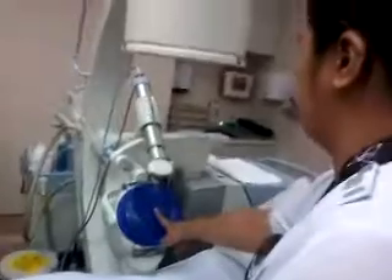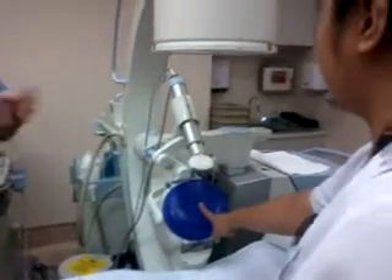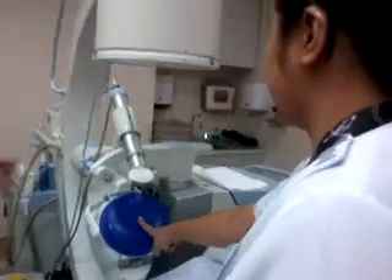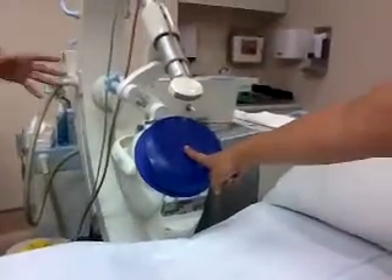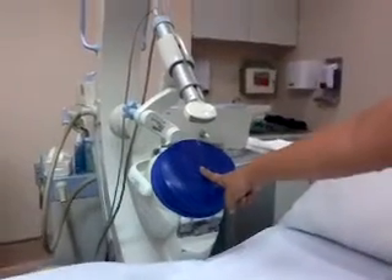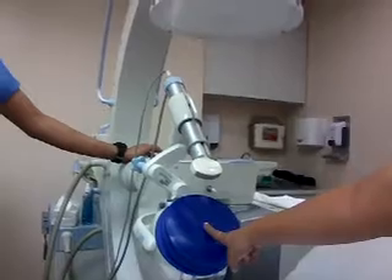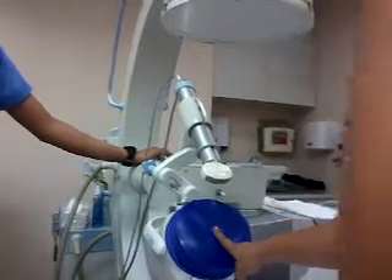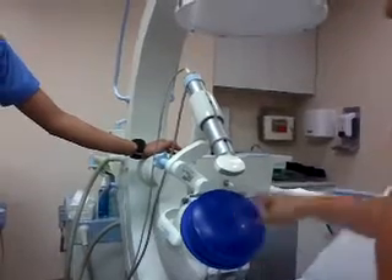I'll be giving you point one energy level. As I said, we go gradually — point one, point two, point three, point four, point five, point six, and so on up to one, one point two. We don't increase abruptly on the patient. I'll be giving point one now.